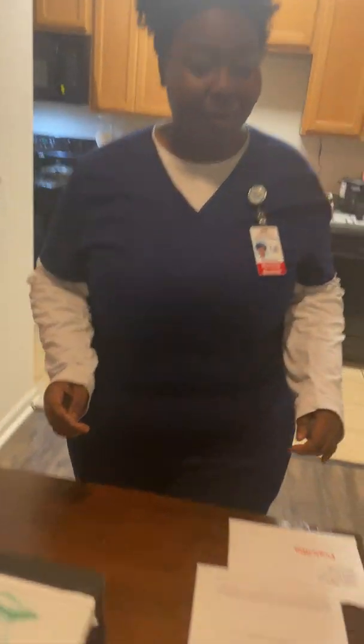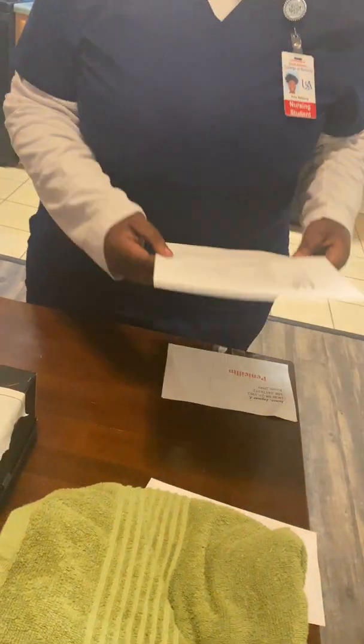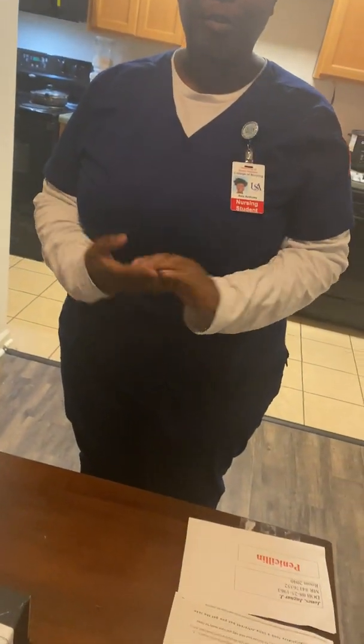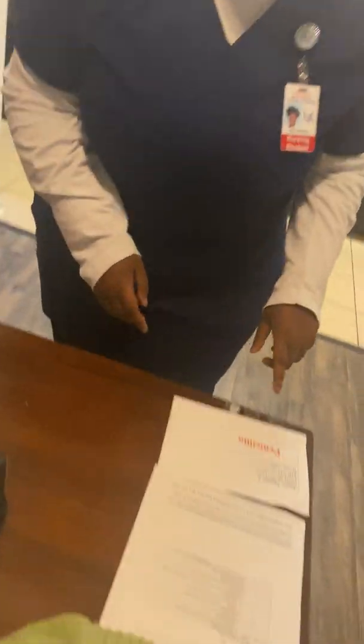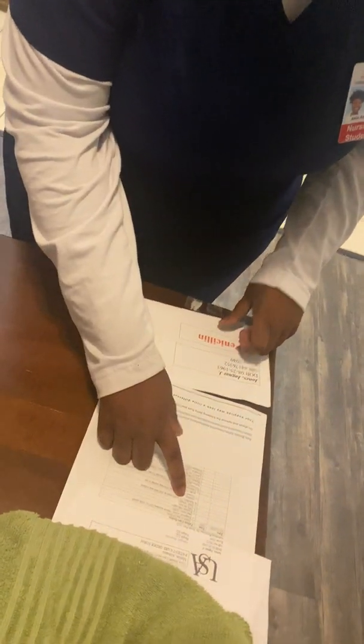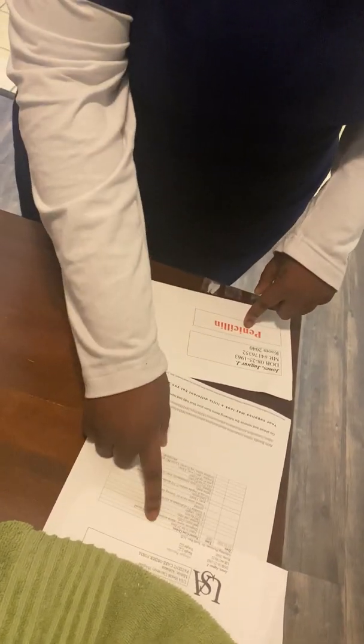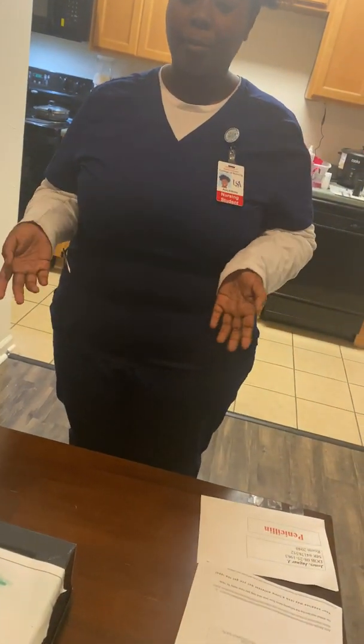Okay, so first I'm going to come in and verify the order and check hospital policy. Then I'm going to perform hand hygiene, and use two identifiers to identify my patient. So Jaguar Jones, A2563. Then I'm going to assess for allergies, so penicillin. Then I'm going to explain the procedure to my patient, that today I'm going to be placing their NG tube, and then I'm going to provide privacy.